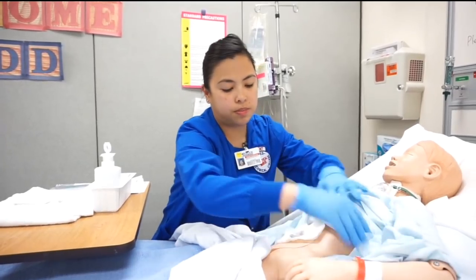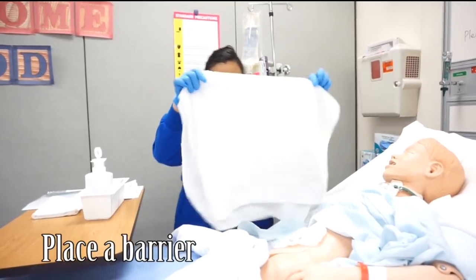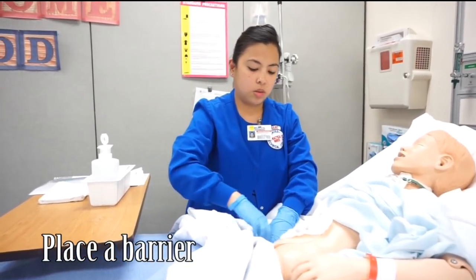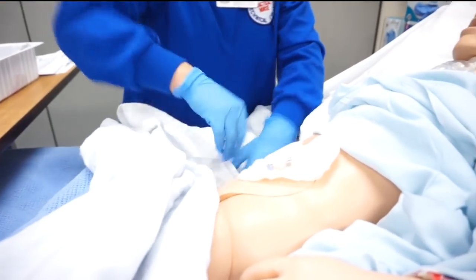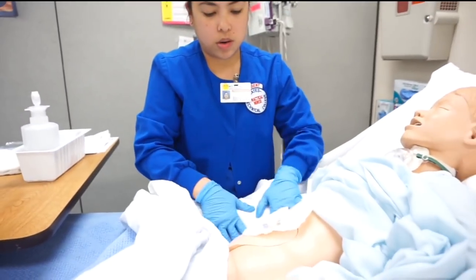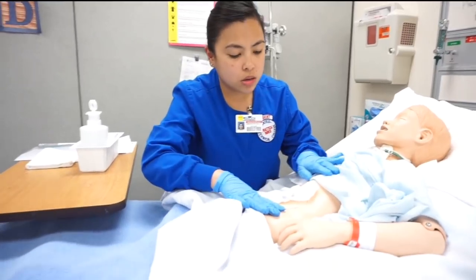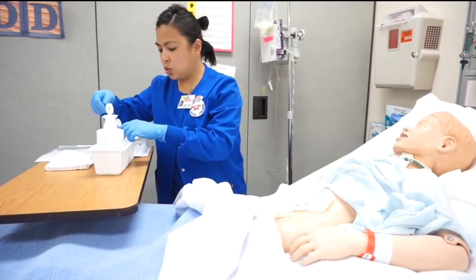This is the most comfortable position for me, and I'm going to expose my client. I'm going to use this blanket and place it underneath, so that way if there's any irrigation fluid, it's not going to wet the bed. Now I'm going to prepare to insert the tube.